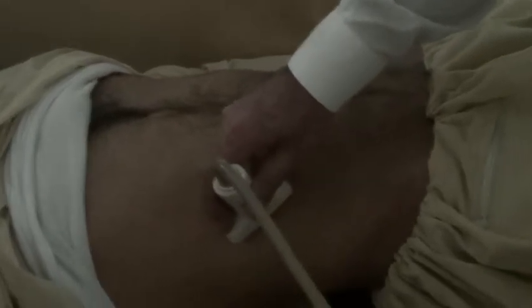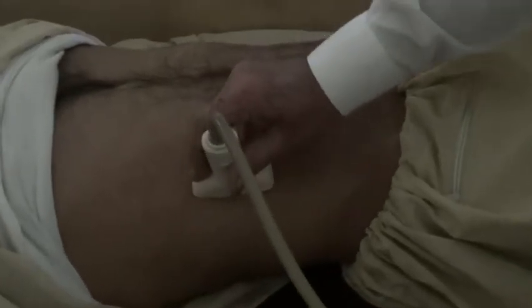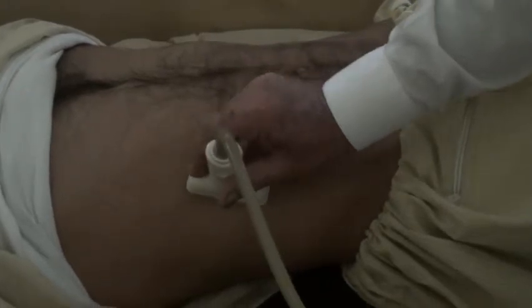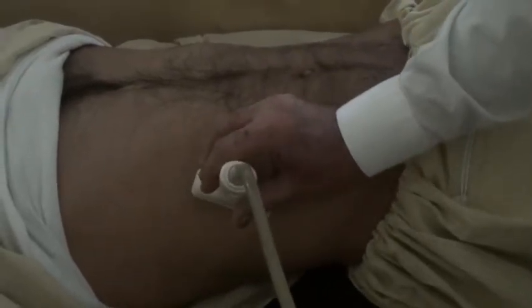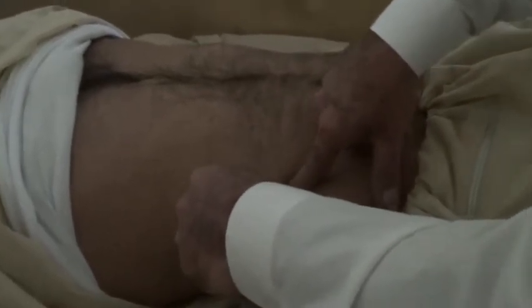caudally. You will move the probe caudally if required, or angle the probe a bit in 90-degree angles to the intercostal space. Now this is the subcostal region. Okay, and these are the intercostal spaces. If I place the probe here, I get the kidney, getting rid of the angling and pivoting in this direction.